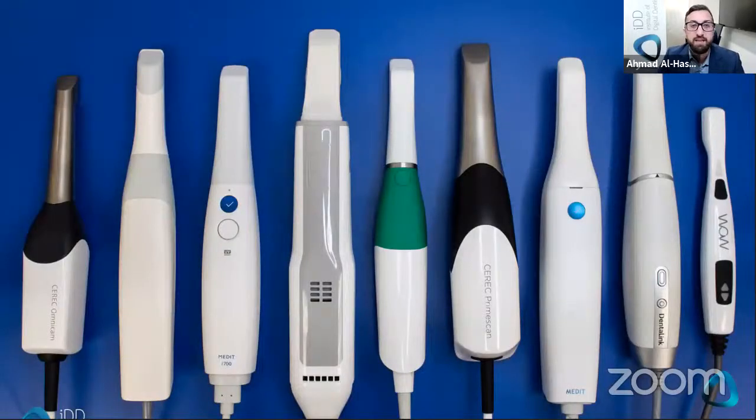And this is something, again, that I've found. These are some of the scanners in our practice. And I've used all of these scanners in-house. And I get asked a lot, which is the most accurate? To me, clinically, they all work. They all work more than enough. They're all definitely sufficient. You're not comparing technology of 5 to 10 years ago.